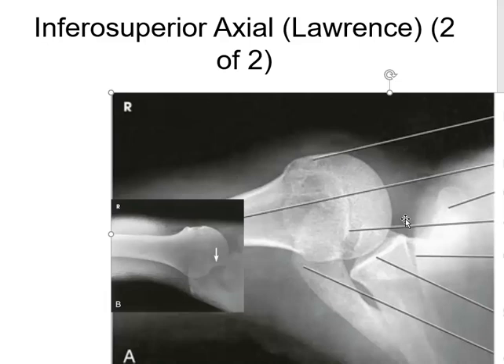And here's the kicker. Turning their head is really to reduce eye dose, but if you don't have them turn their head in the opposite direction and tuck their chin, sometimes you can't get the image receptor far enough into their neck in order to get the humeral head.